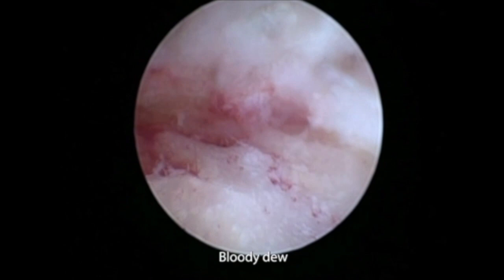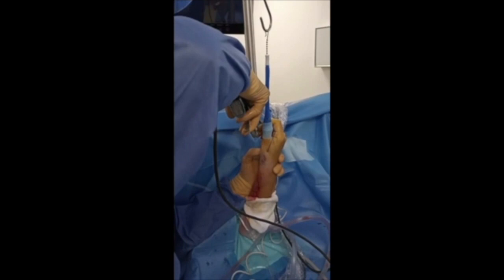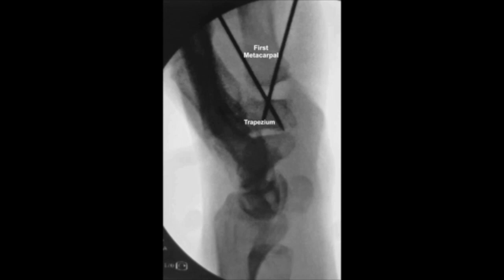Concerning the bone fixation, limb traction was maintained and two divergent pins were placed under fluoroscopic control to maintain the joint space and promote the development of a postoperative hematoma. Two wires were introduced using a motorized driver from the base of the metacarpal to the body of the trapezium.